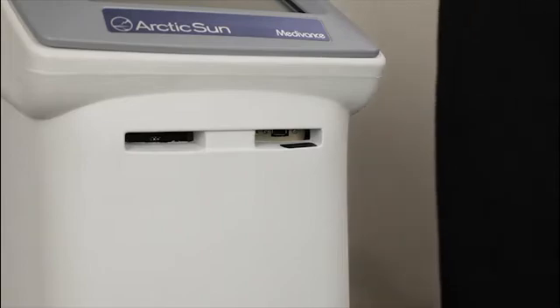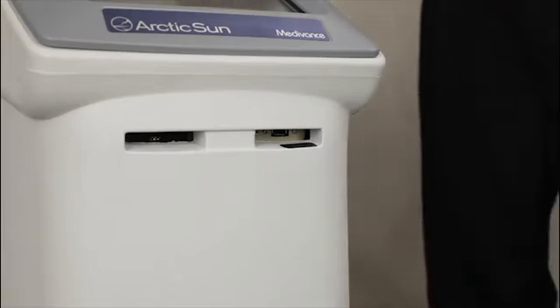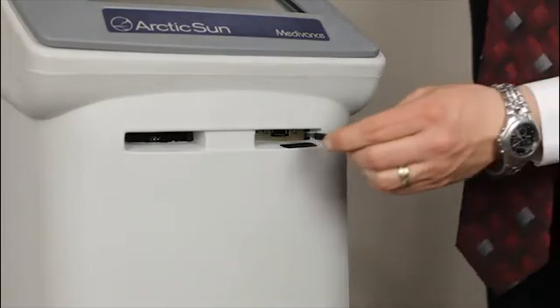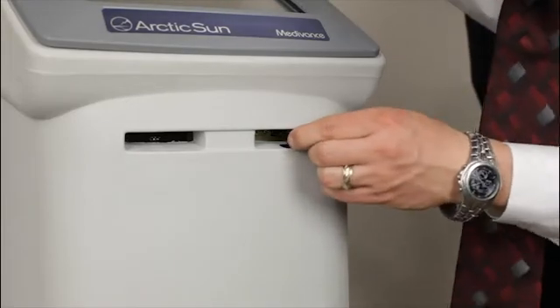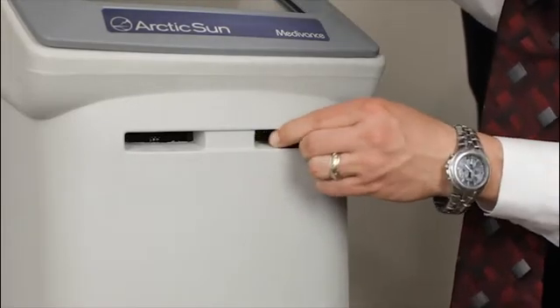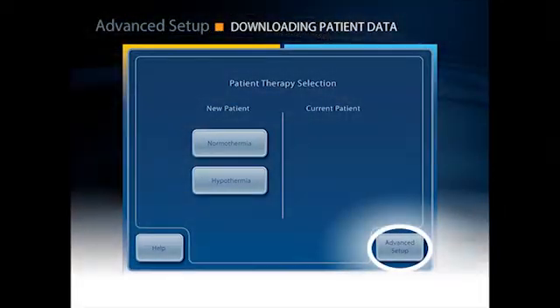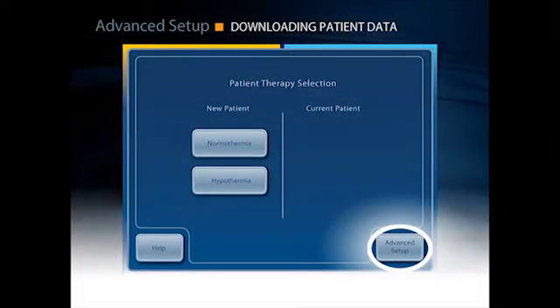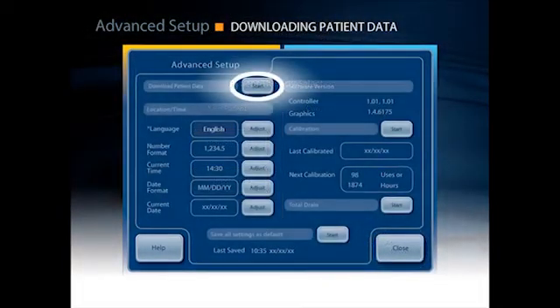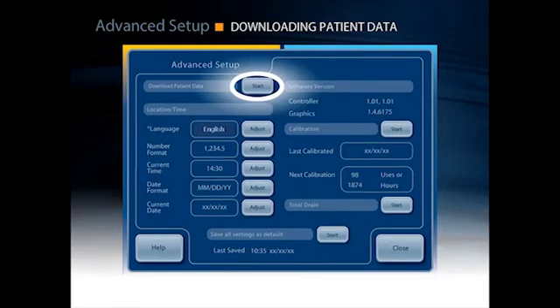To download the patient data stored on the device, insert a USB into the front of the device. From the patient therapy selection screen, press the advanced settings button. Then press the start button next to the download patient data option.